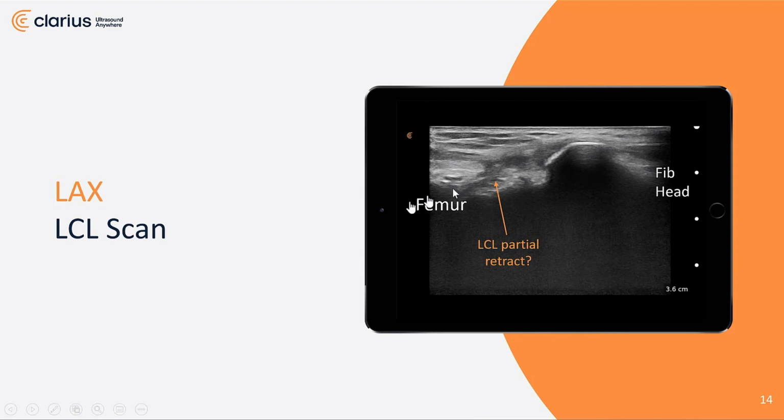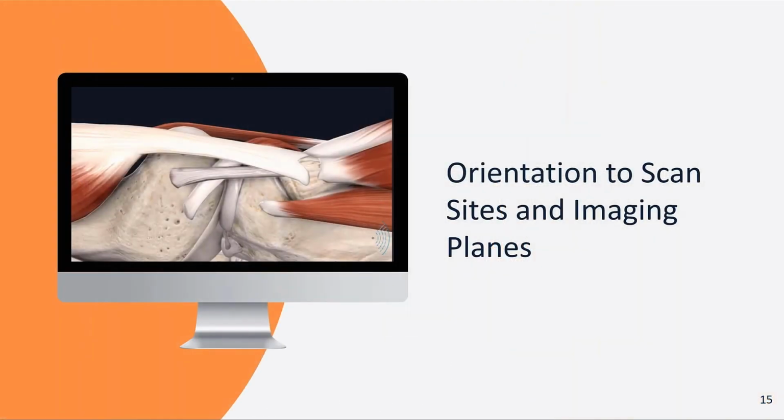You'll see almost a stub-like formation here on part of the lateral collateral ligament, and that corresponds nicely to the darkness of fluid. However, it's not just fluid that ultrasound is able to identify. We can overlay on the images that are coming from our scanner a tool that allows us to identify if there is excess blood flow or new blood flow to a region.